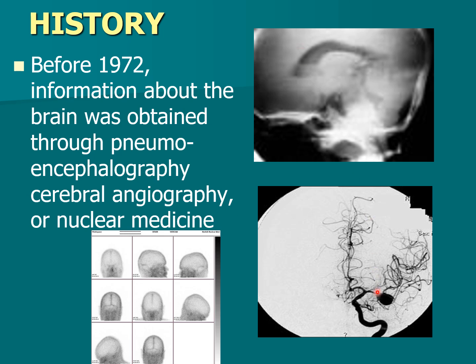You also could do a nuclear medicine scan. We don't even do this anymore. I'm also a nuclear medicine tech, but you would do scans and the radionuclide would show up if there was a tumor. Again, it wouldn't show the soft tissue itself. It would usually show an area of increased activity, which usually was malignancy, or an area of decreased activity, which is where the brain was dead. So it was very rudimentary, but we had that.